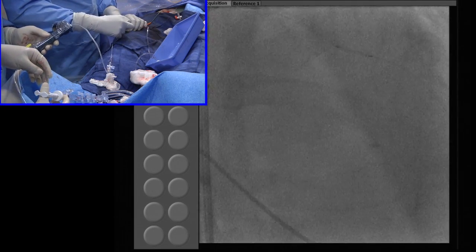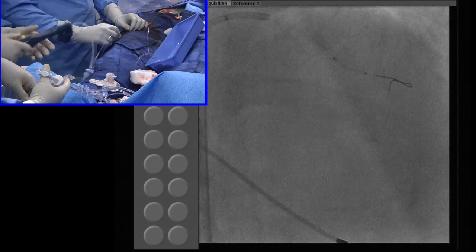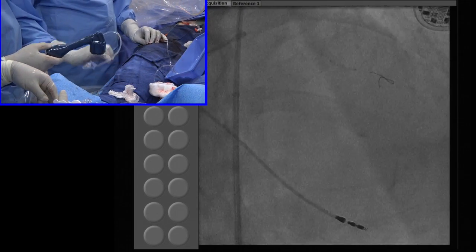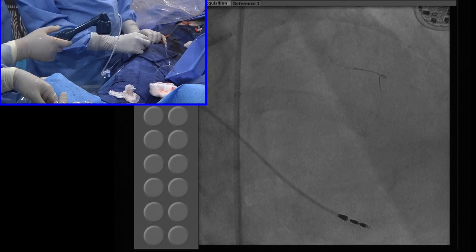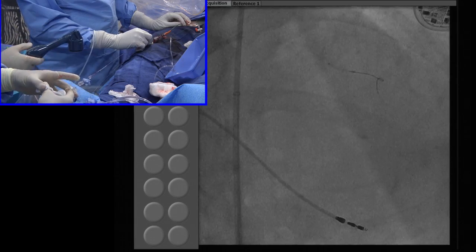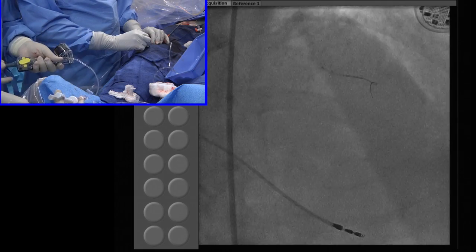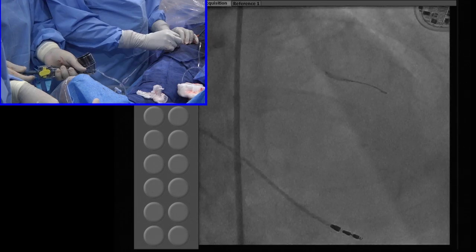So that is the 2.25 stent back there. Yeah, same. We went with the same one; all it needed was more expansion, more aggressive dilatation with the non-compliant balloon. That's right. Yeah, that's nice. Good job. Sometimes actually pulling the buddy wire out in a small vessel like this helps. Okay, but the angle, as Dr. Kenny was saying, it really is related to the angulation there. Okay, good. I think even changing the guide wire may have also contributed there, but a host of factors.